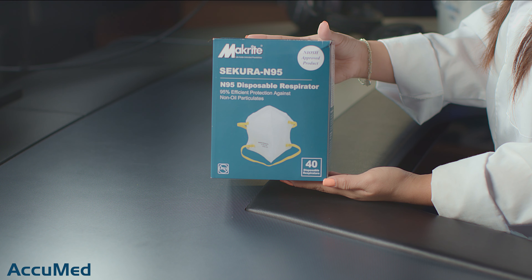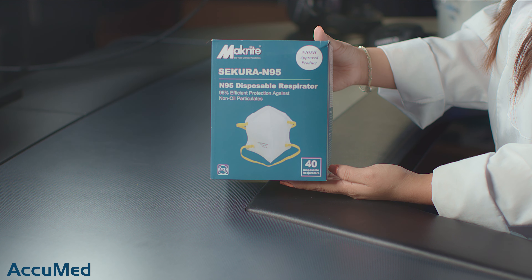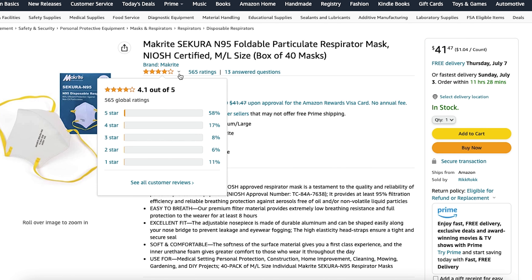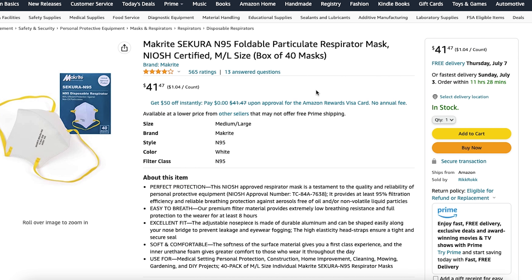Hello everyone and welcome back to the AccuMed channel. Today we're going to be reviewing the MacRite Secura N95. They come in a box of 40 for $41.47. They also have a 4.1 out of 5 rating with 565 reviews.